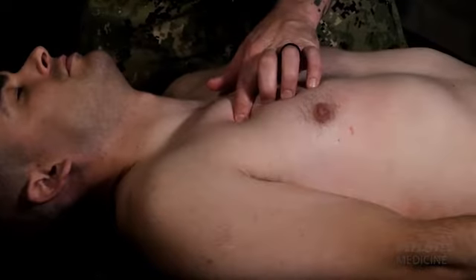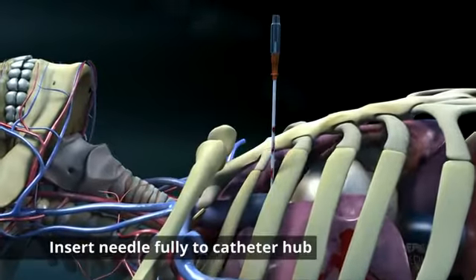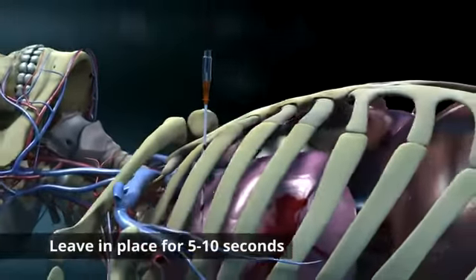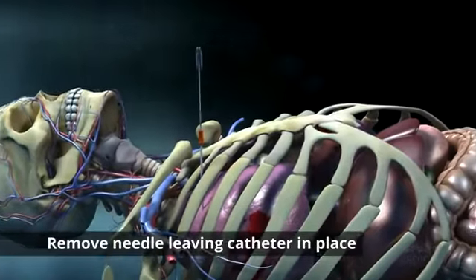I have my site identified, and I'm just going to insert this at a 90-degree angle, perpendicular to the patient's chest. Insert the needle and catheter fully to the catheter hub and leave in place for 5 to 10 seconds to allow complete decompression to occur. After the decompression has been performed, remove the needle, leaving the catheter in place.